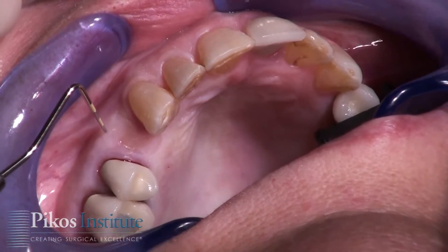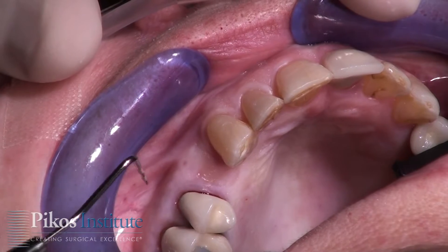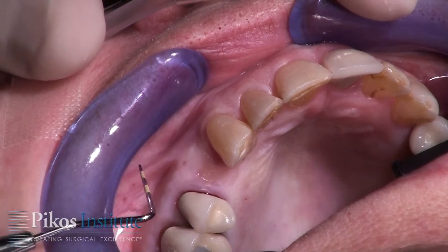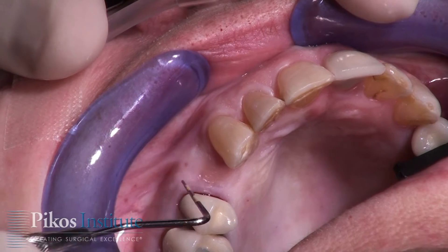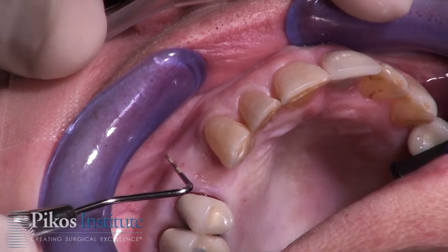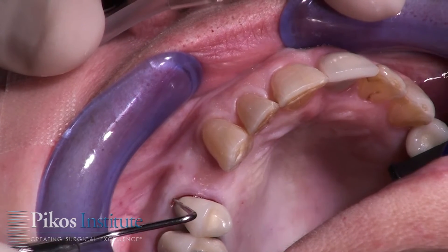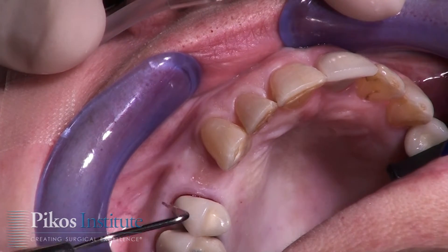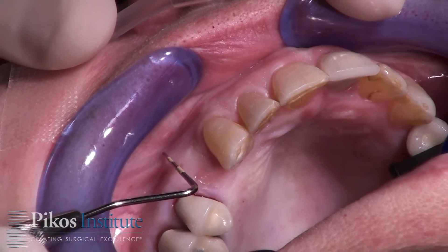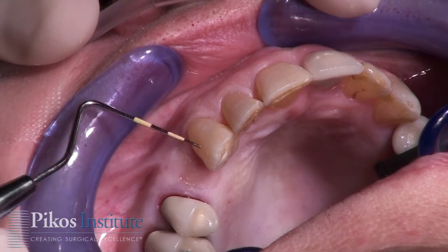From approximately here to the crest is what we'll be looking at for emergence. Most importantly, we want to be 3 millimeters apical to the free gingival margin. That's the most important parameter for vertical placement of the implant.